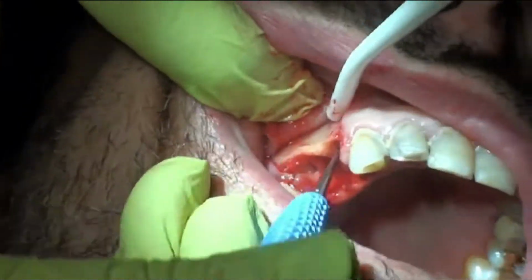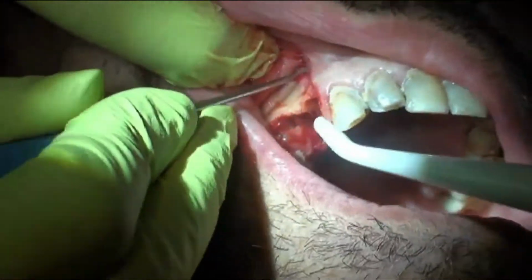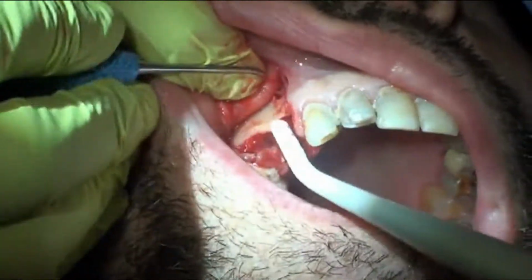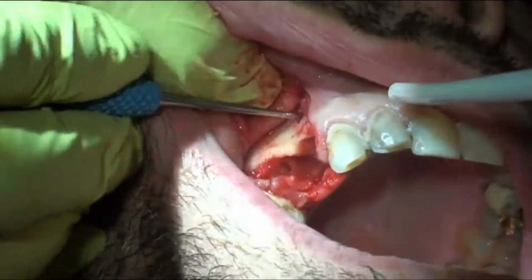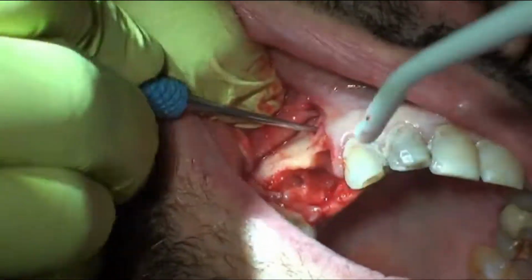Yeah, that end of tooth number 5, there were the ligaments we couldn't follow. Okay, it also goes buccally. I perforated the buccal, so now we go get all the infection out.